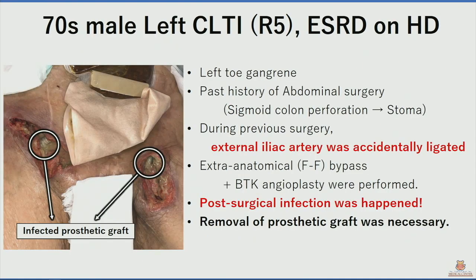A 70s male, he was on dialysis, came to our hospital due to left gangrene. CT angiogram disclosed left iliac artery occlusions and below the knee diseases. Of course, we tried to do endovascular recanalization for the occluded left iliac arteries. However, this patient had a terrible history.